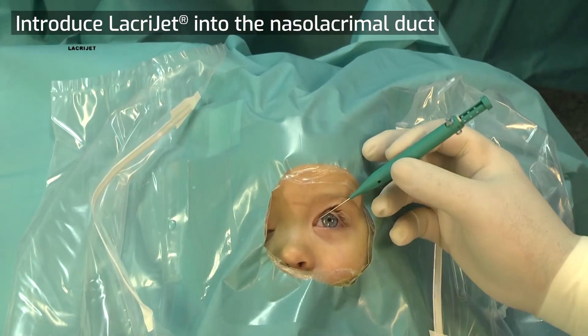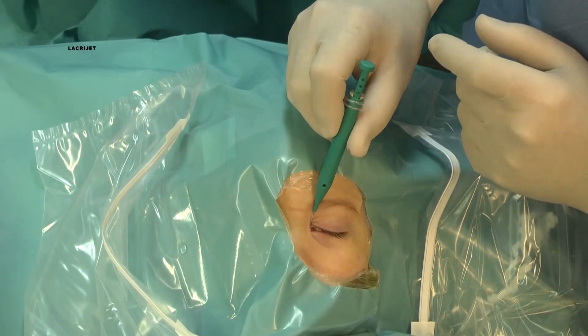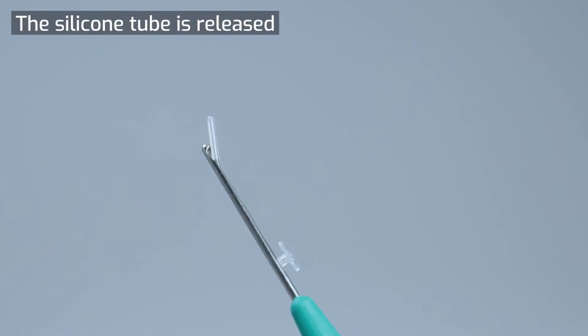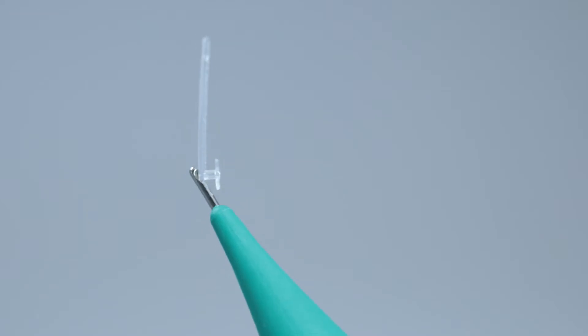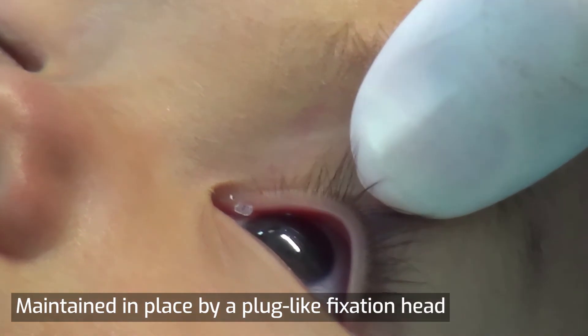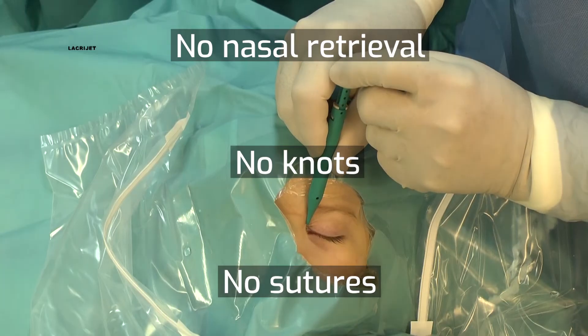The LacriJet is first introduced into the nasal lacrimal duct. Once in position, the sliding piston is retracted and the silicon tube is released. It is maintained in place at the punctum by a fixation head. No nasal retrieval, no knots, and no sutures are needed.